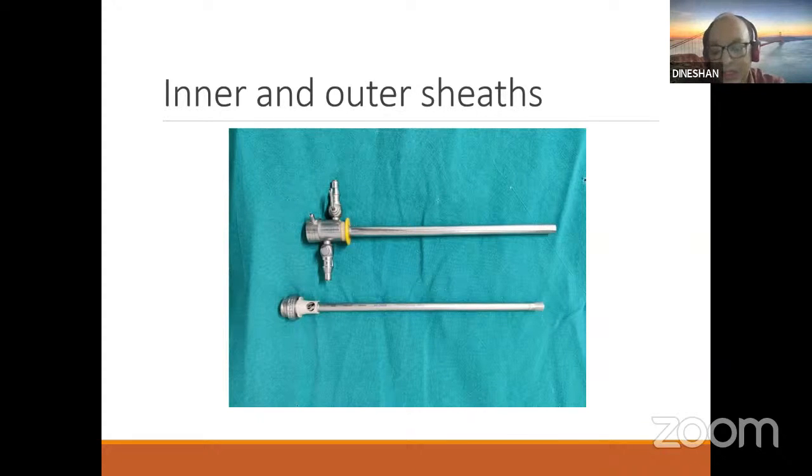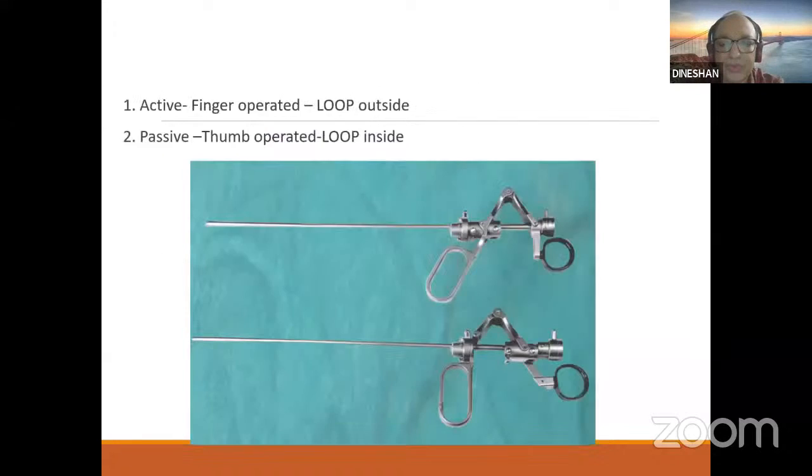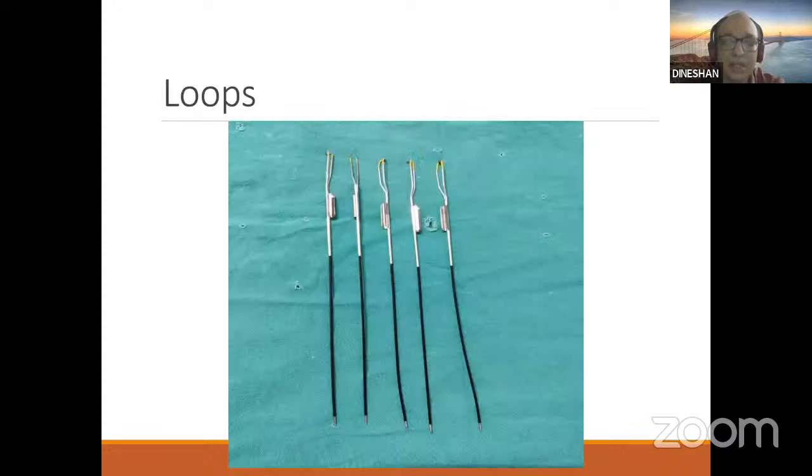But if it is an acute angle, it will go more inside, and chances of damage to the ceramic tip and current transmission to the sheath can also occur. So it has to be made sure that it is always at a right angle.